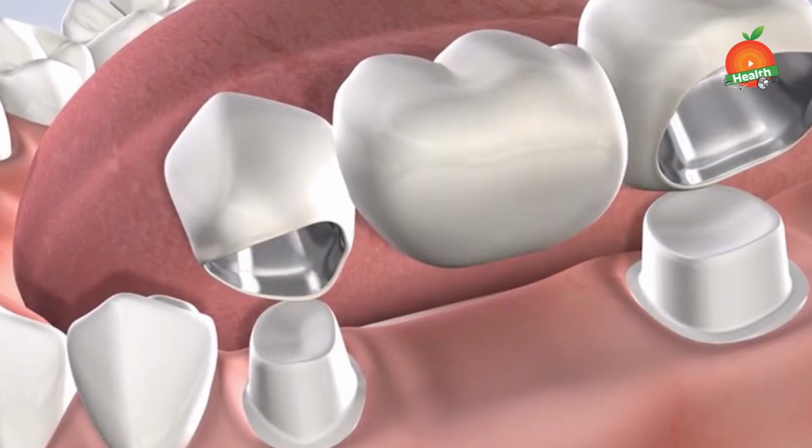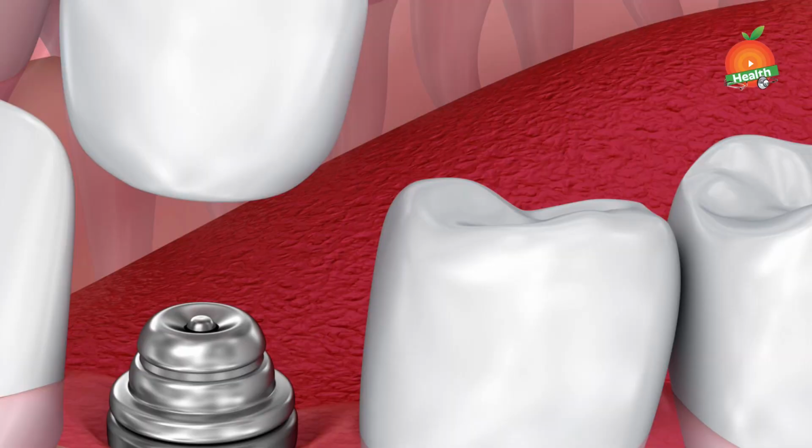replace the teeth. In this artificial replacement procedure, we have two options for the fixed one. One is shaping the neighboring teeth, and the other is taking support of the underlying bone. Taking support of the underlying bone is called implantology, where we place an implant in the bone and we have to wait a minimum of 4 to 6 months for the bone to come and adhere to the implant.